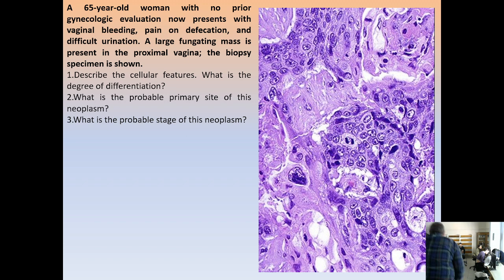What do we do next? We try to find the differentiation. Firstly, to make the diagnosis, the histogenesis of the tumor, because most probably the tissue to which a neoplastic population differentiates is the same tissue from which it arises. For example, an adenocarcinoma arises from glandular epithelium. However, there is one characteristic in the cytoplasm of these cells which helps us postulate where it comes from.